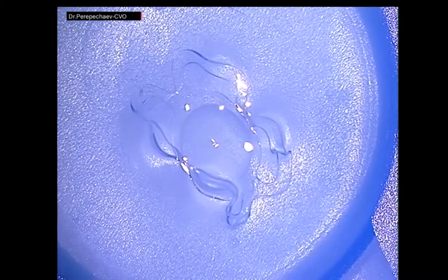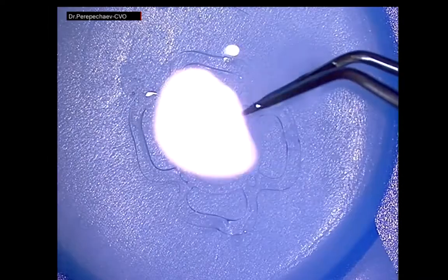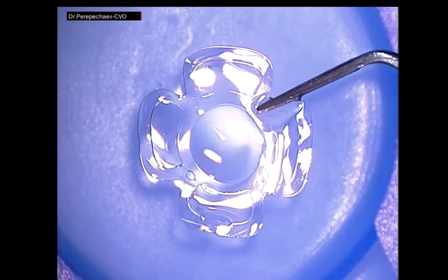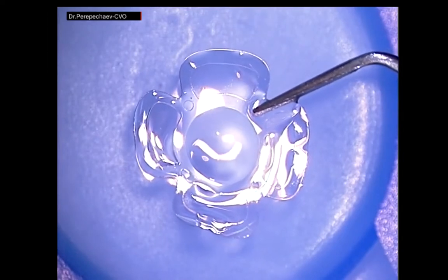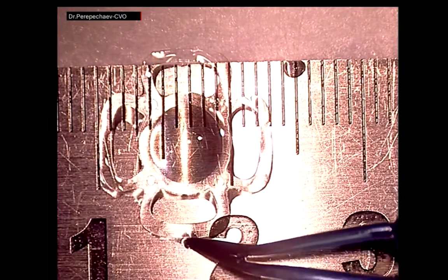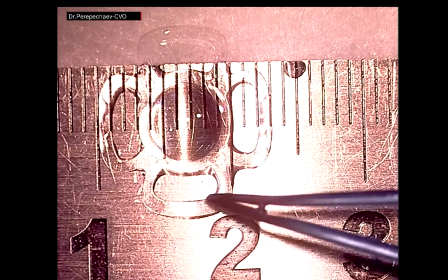If the lens was folded correctly, it comes out of the nozzle of the injector in the form of a smooth tube and immediately begins to unfold. After 20–30 seconds, the lens fully unfolds and regains its shape. The implantation was successfully completed. Now you can see the overall appearance and dimensions of the lens immediately after implantation. 13 mm overall lens size and 7 mm optical part.